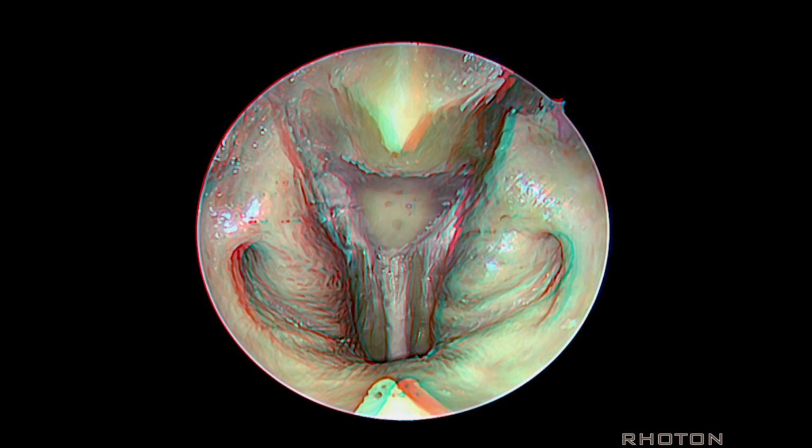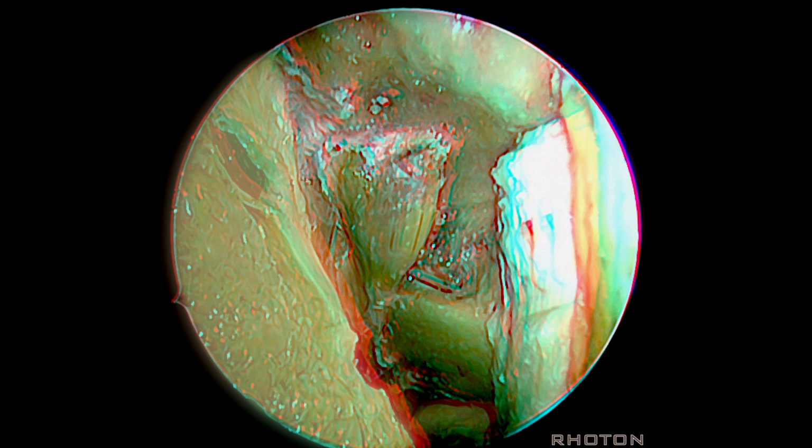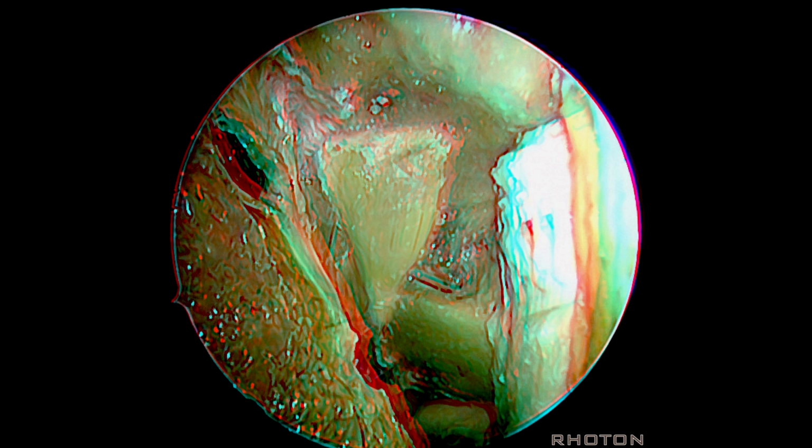Longus capitis. The clivus is straight ahead in the transnasal approach. Here we pull the longus capitis laterally, and we see rectus capitis anterior, crossing the atlanto-occipital joint from clivus to C1. We're looking laterally with a 45-degree endoscope.